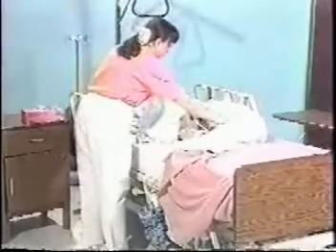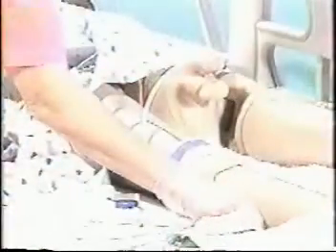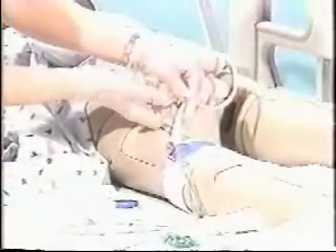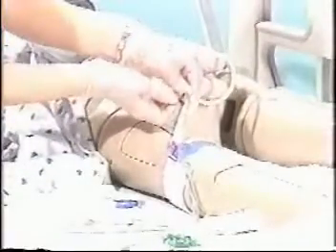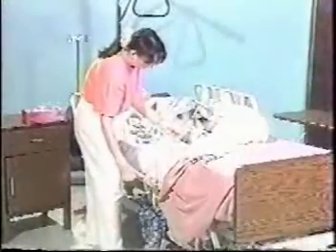Place bed protector under the connection between the catheter and the drainage tube. Clamp the catheter. Drain the catheter tubing of urine. Open the sterile catheter plug.